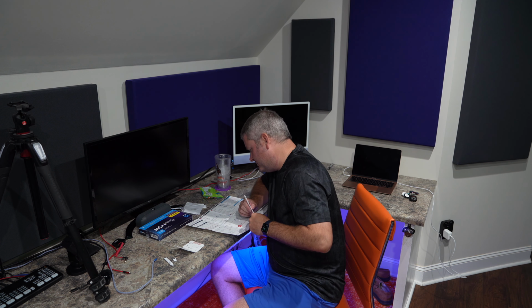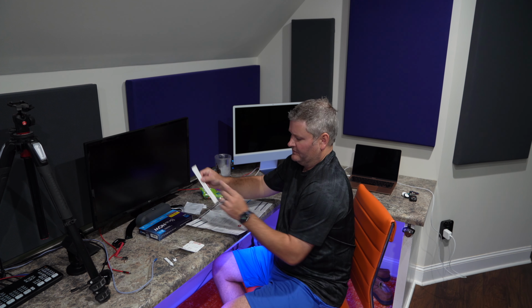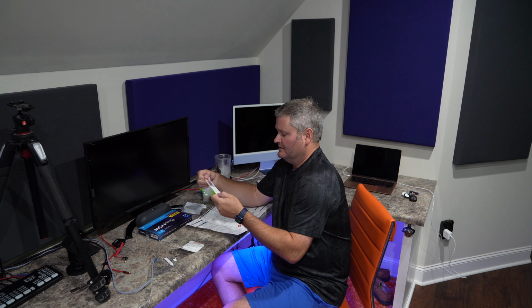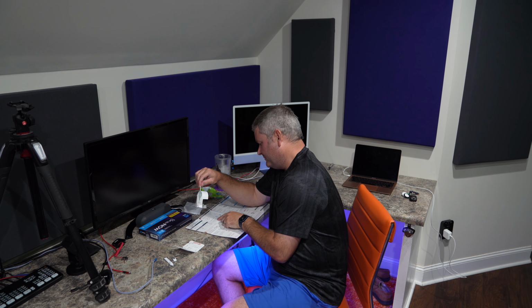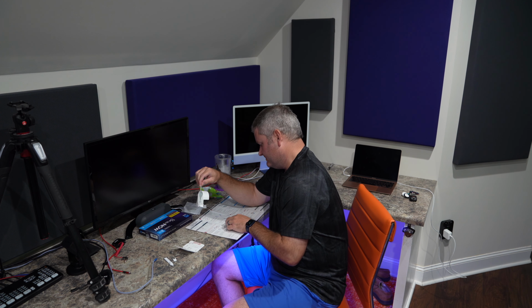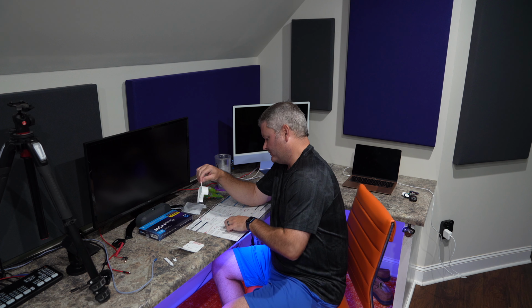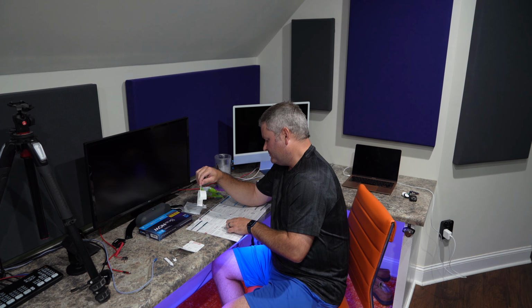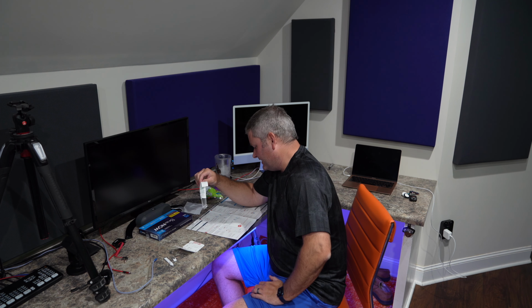Now it says open the swab, on the stick end, not the end with the soft tip, because if you were unknowingly contaminated, you wouldn't want to grab the swab there. So we're going to grab this. It says insert the entire soft tip of the swab into a nostril, usually a half to three-quarters of an inch. Using medium pressure, rub the swab against all of the inside walls of your nostril. Make at least 5 big circles. Do not just spin the swab. Each nostril must be swabbed for about 15 seconds. Using the same swab, repeat in your other nostril.